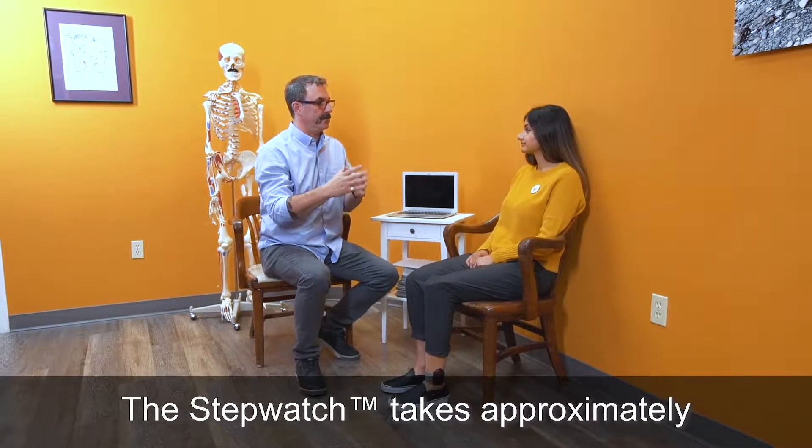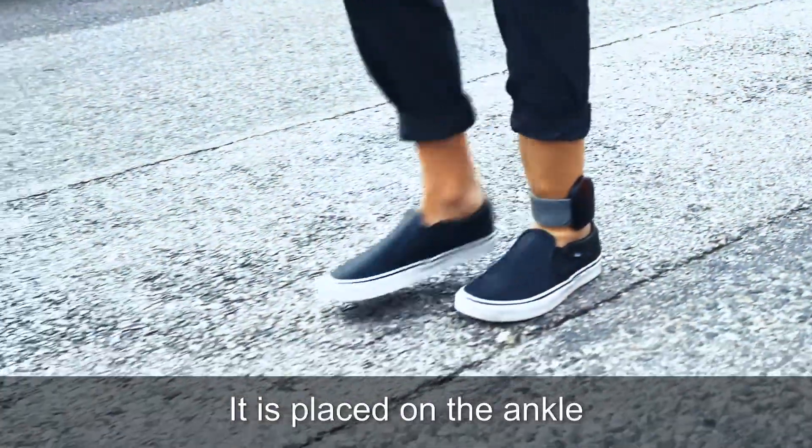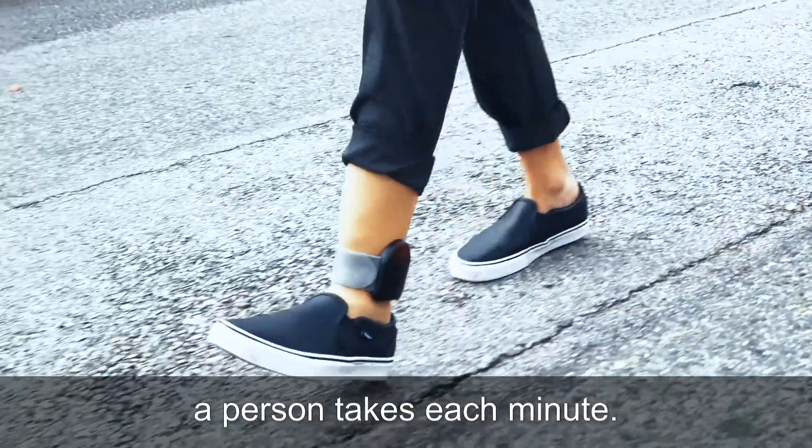The StepWatch takes approximately two minutes to set up and records data for up to 50 days. It is placed on the ankle and measures how many steps a person takes each minute.